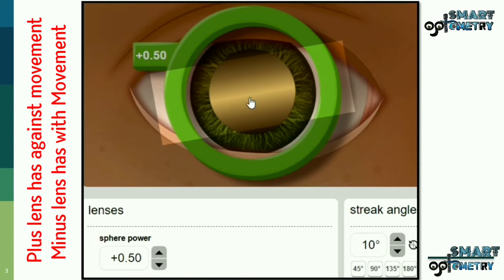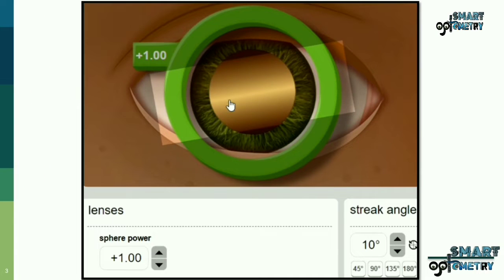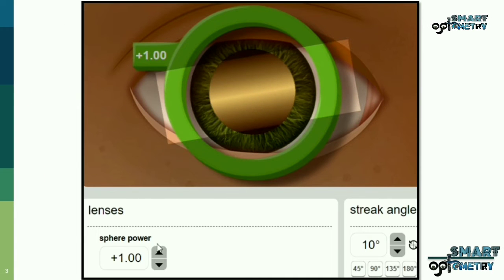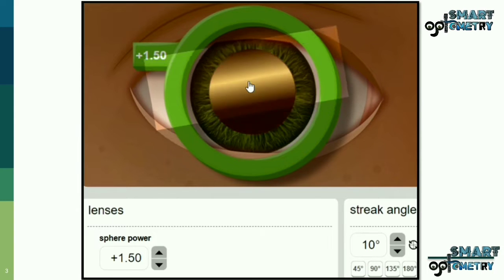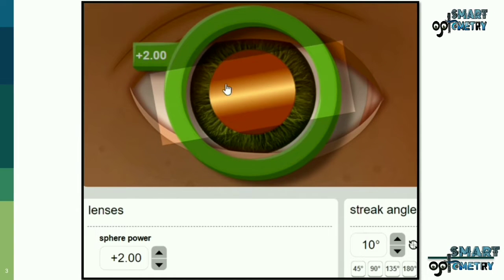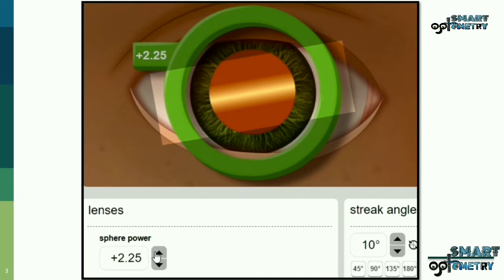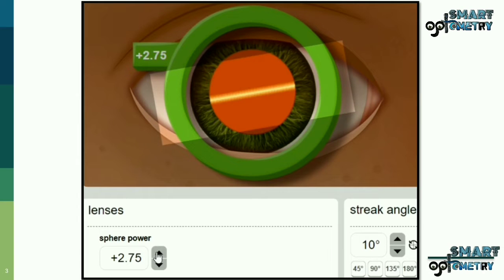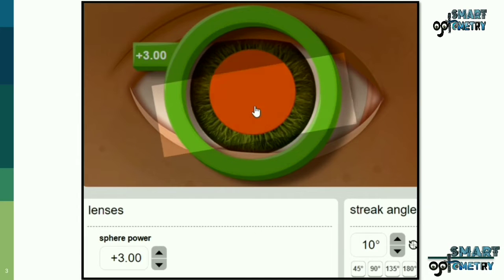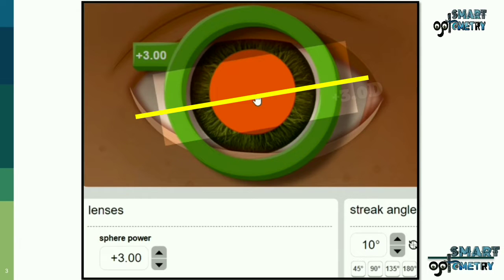With plus 0.5, it's still with movement. With plus 1, still with movement. With plus 1.5, still with. With plus 2, still with. With plus 2.5, still with. Finally, with plus 3, this meridian gets neutralized. So in this meridian, at 10 degrees, we have plus 3.